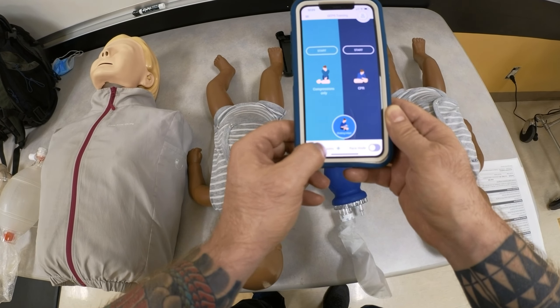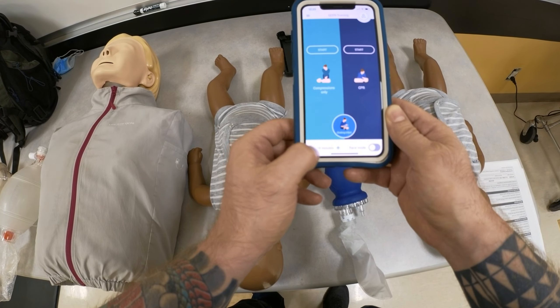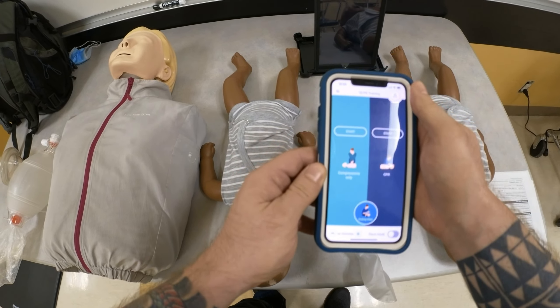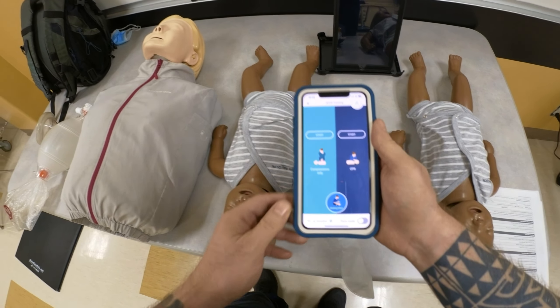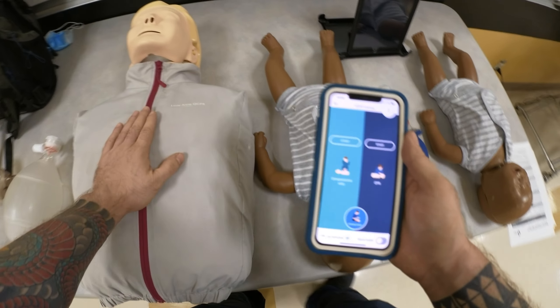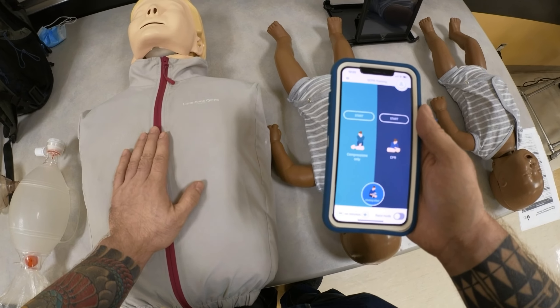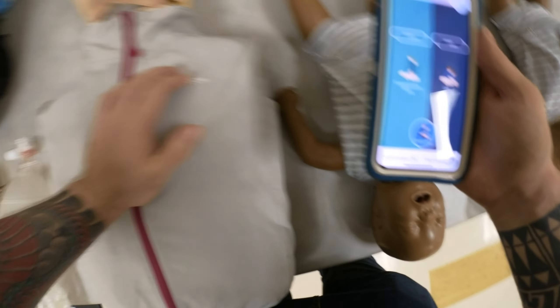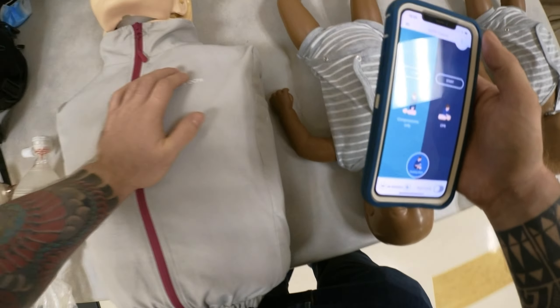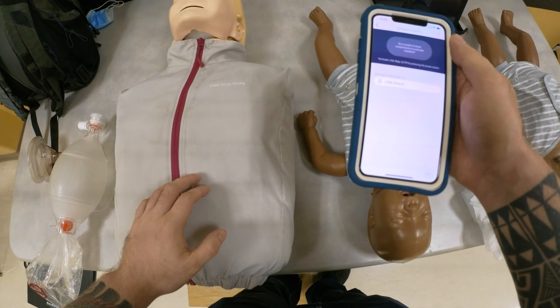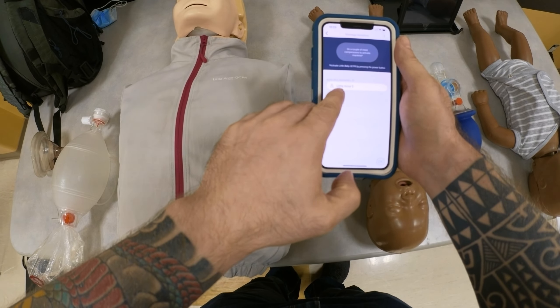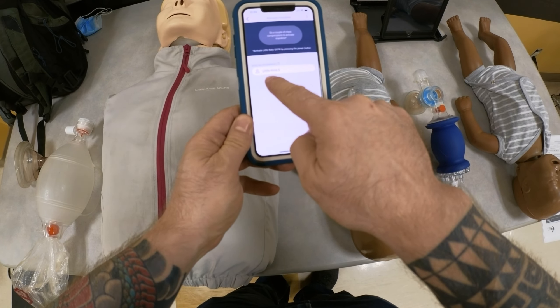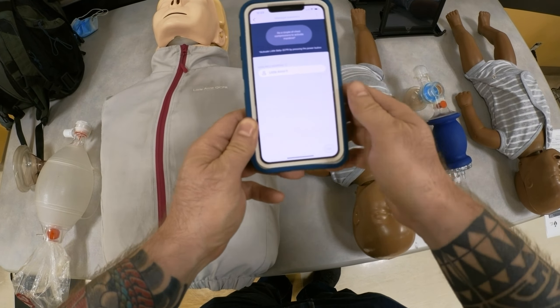At the bottom you see the minutes — I usually set that to infinity. Now we're going to connect. For Little Anne QCPR, you're just going to do a few compressions, and then I'll go into my screen — and you can see Little Anne showing that it's available.